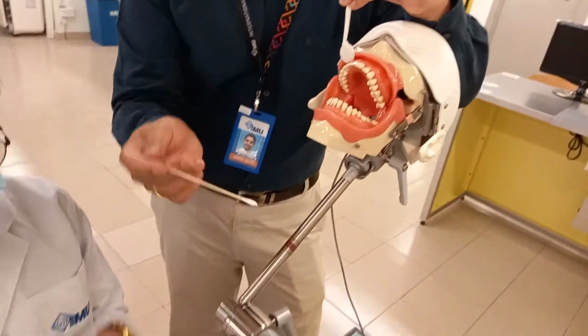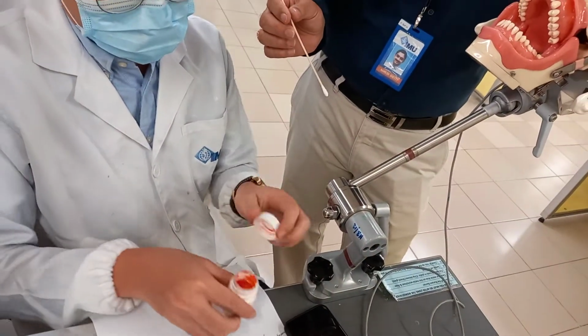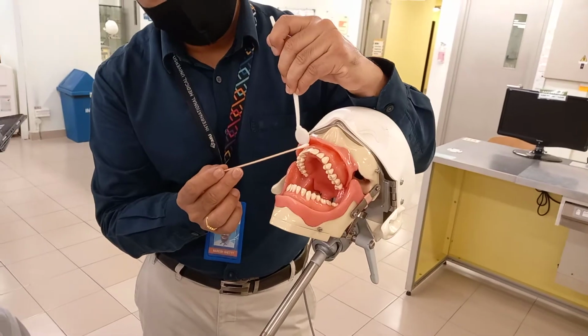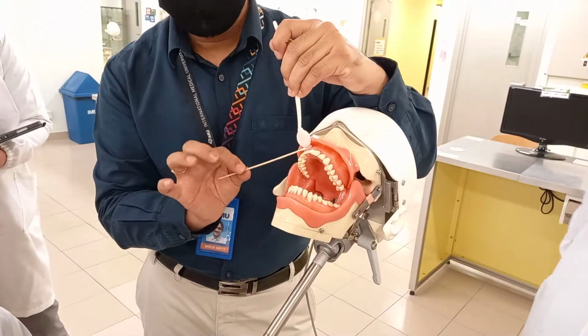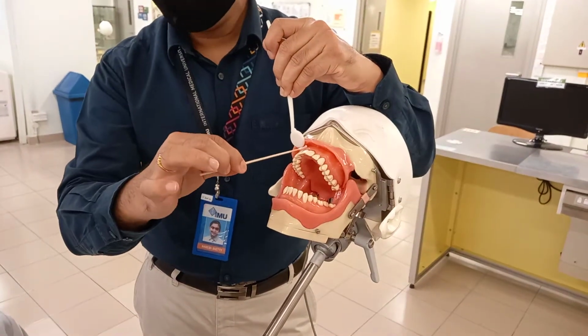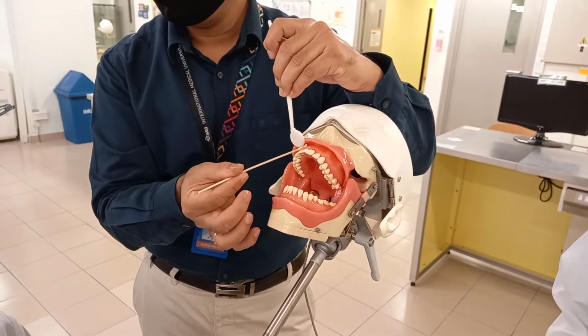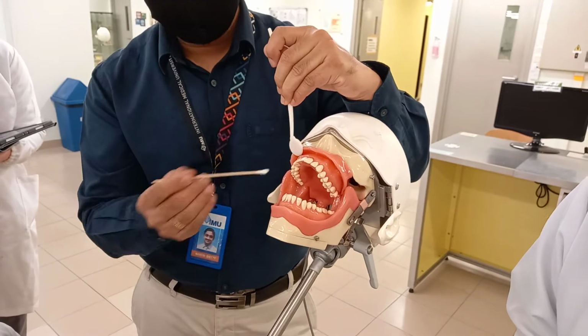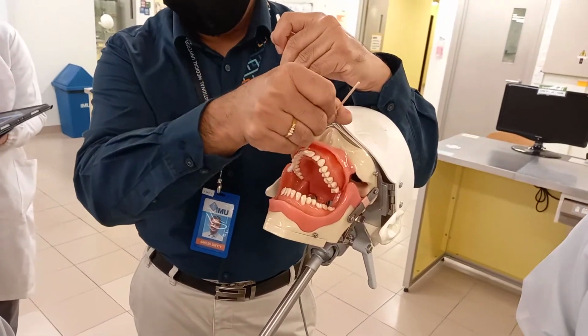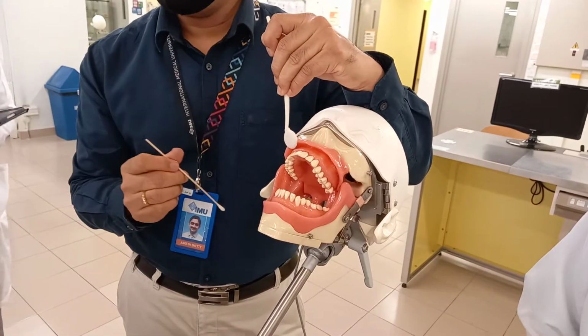You take the topical. So we just open. Okay, so you take the topical and then you apply it in that area. Then you just rotate like that, because if you keep it like this, it won't stick there. It will just come down because of gravity. So keep it like that and just rotate, and then the topical will stay there.